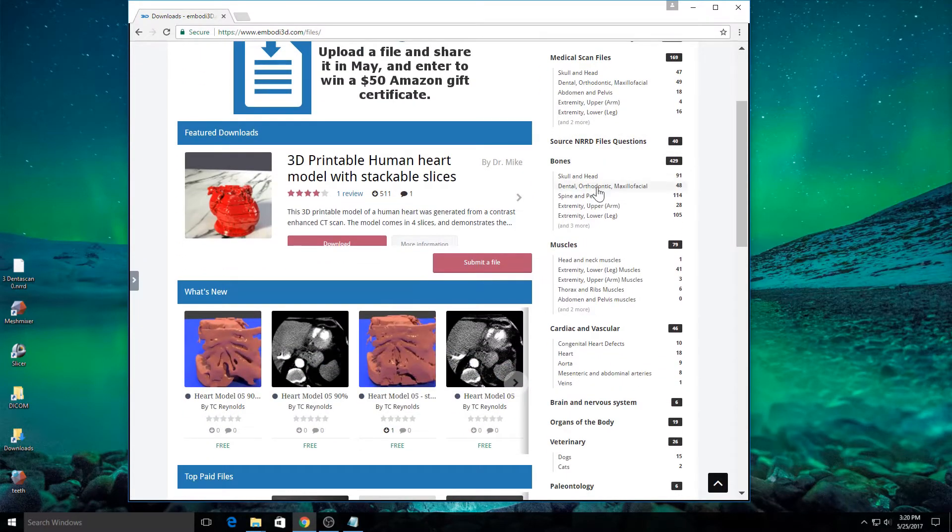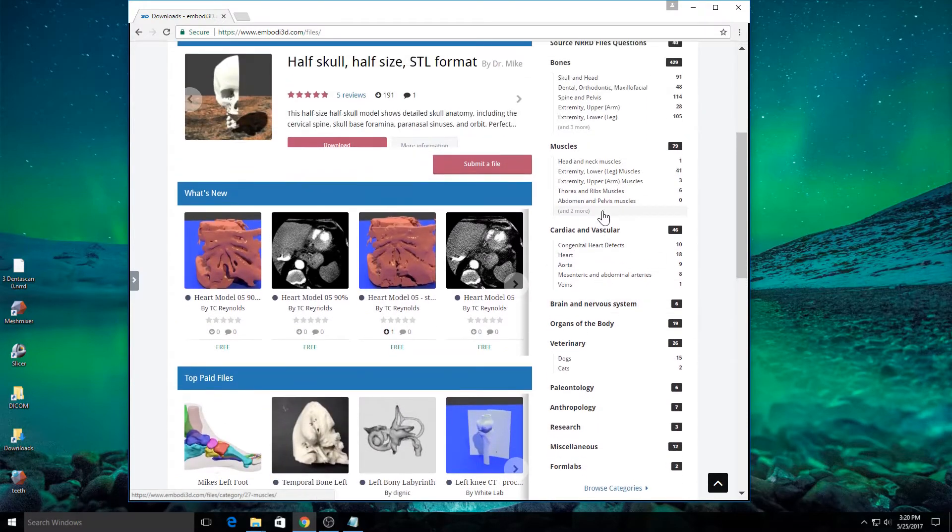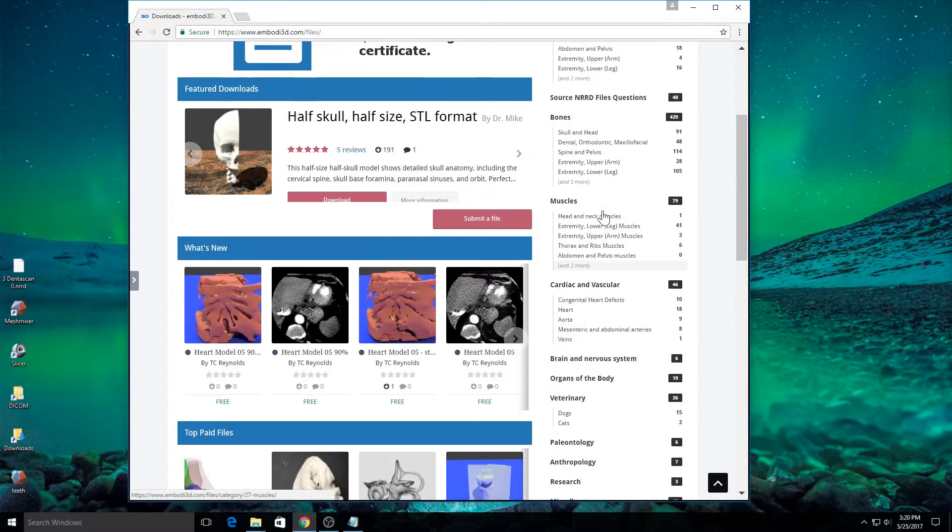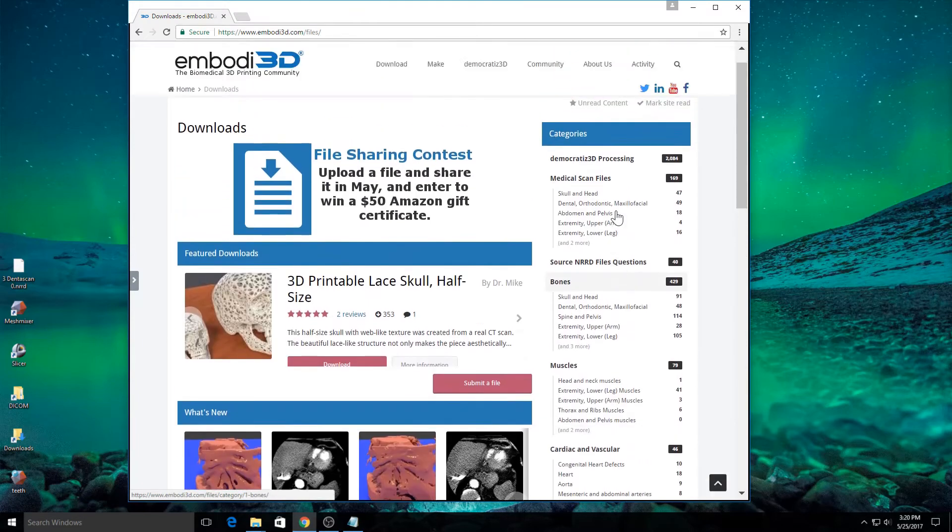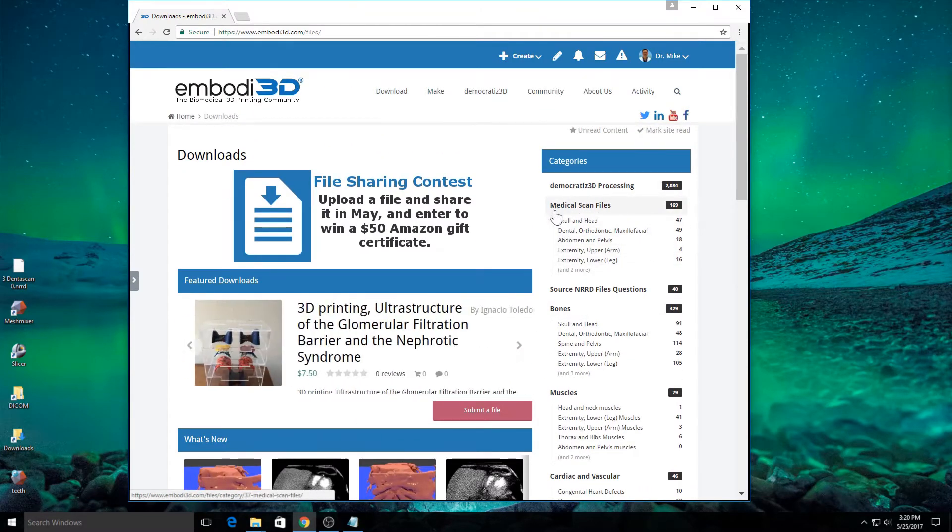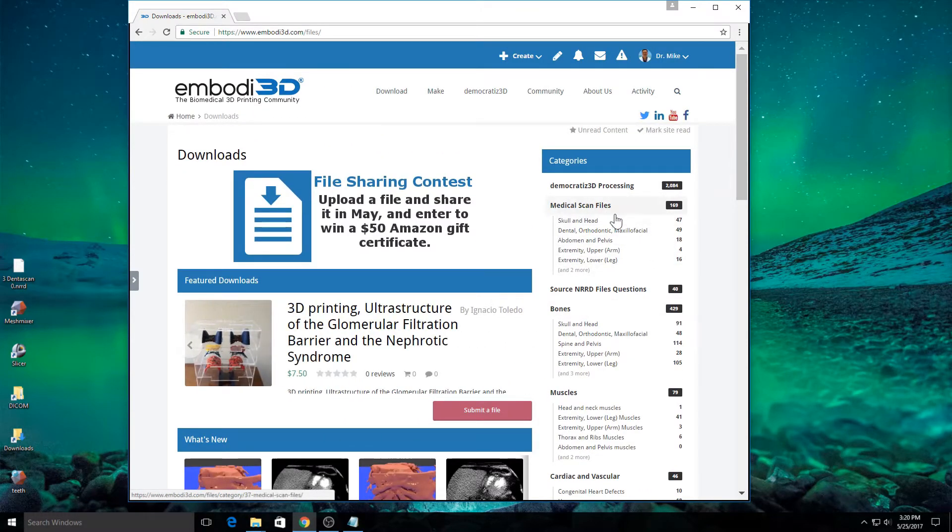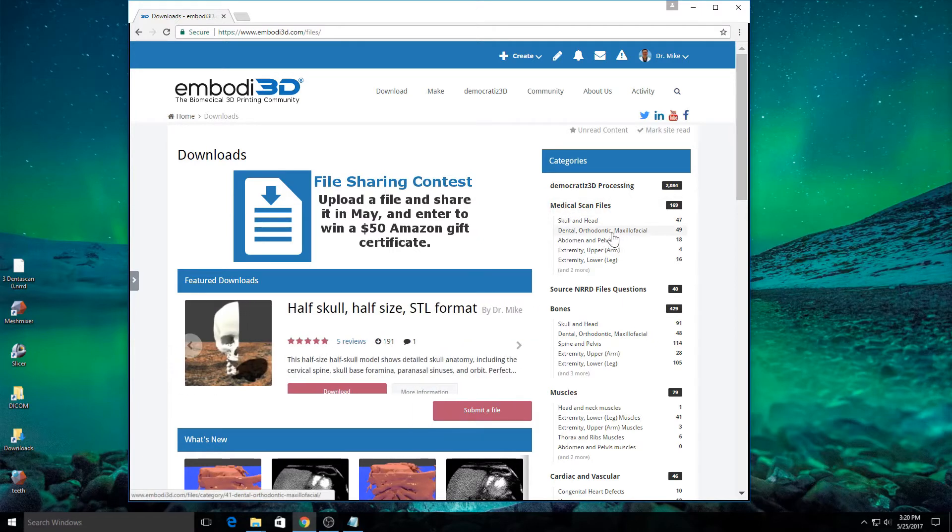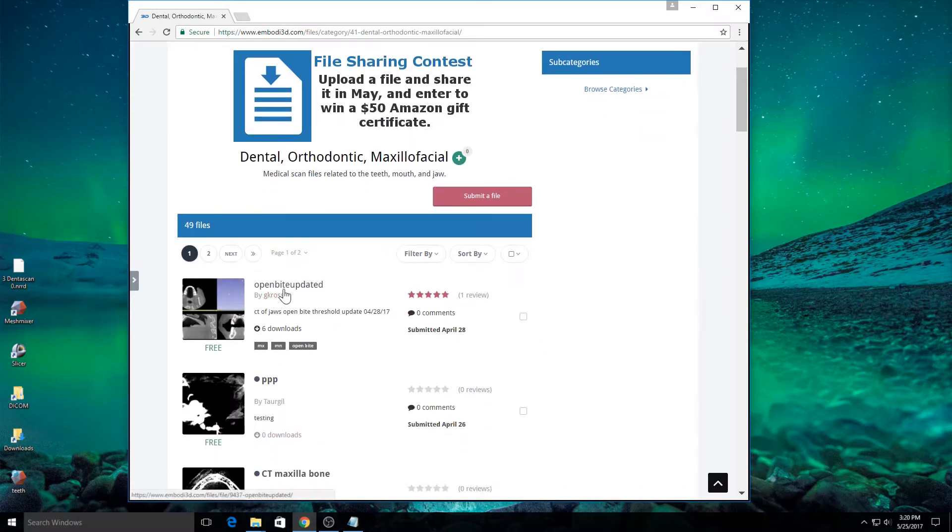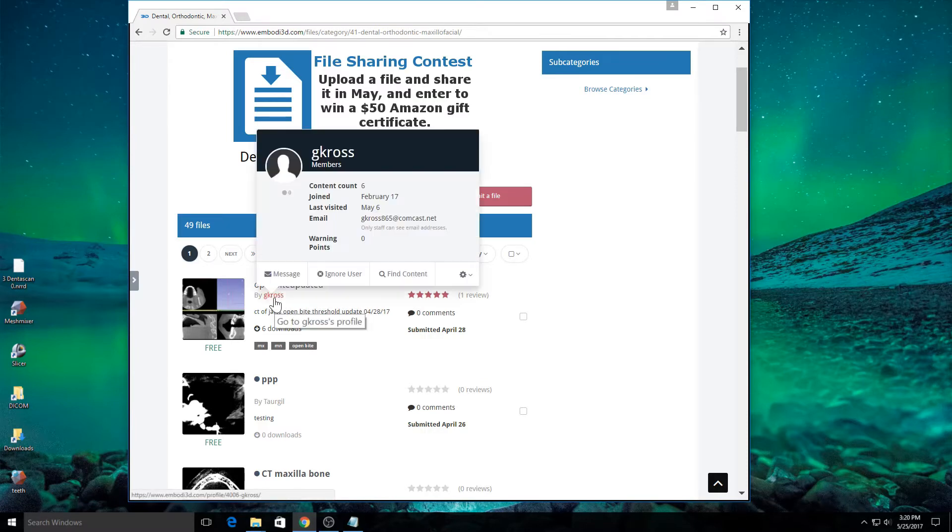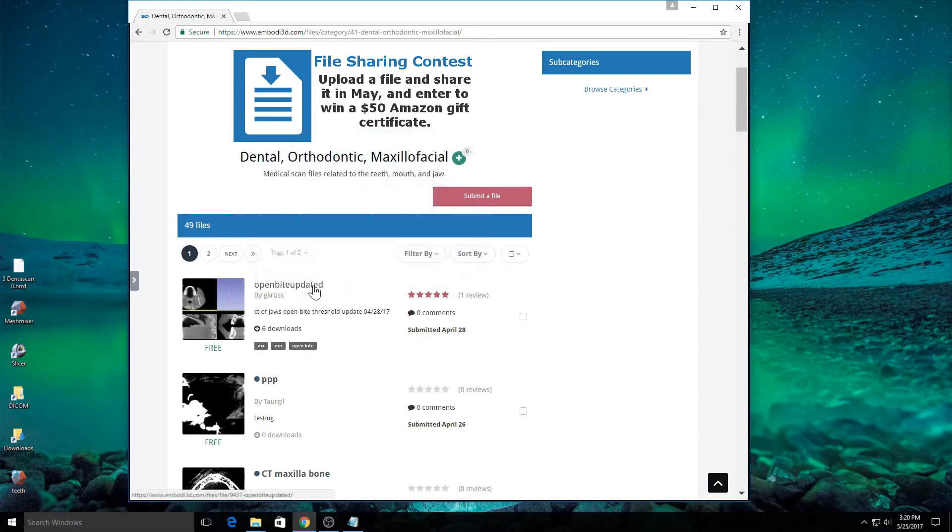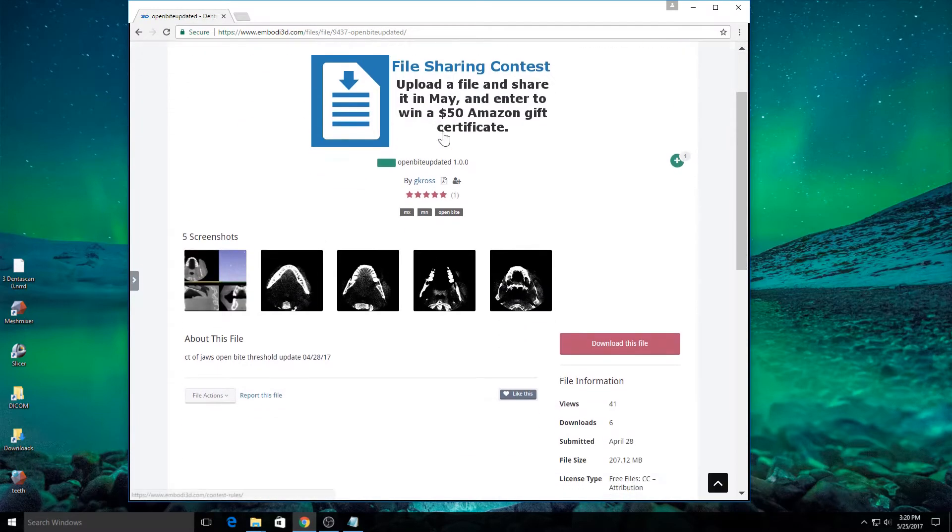There are a variety of files. Most of these files are for 3D printable models. But what we're interested in is medical scans. We're actually going to download a dental CT scan. Make sure you go to under category to medical scan files and click on dental, orthodontic, and maxillofacial. We'll use this first file called OpenBite updated which has been shared and uploaded by our member GCross. Let's go ahead and click on this and click on download this file.